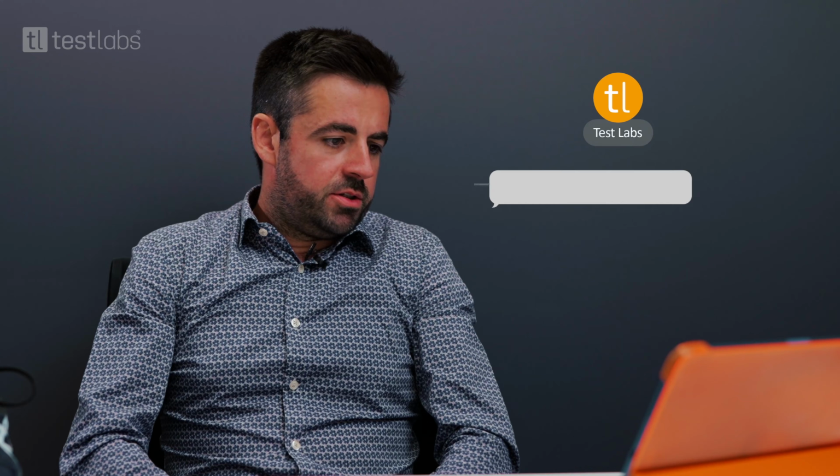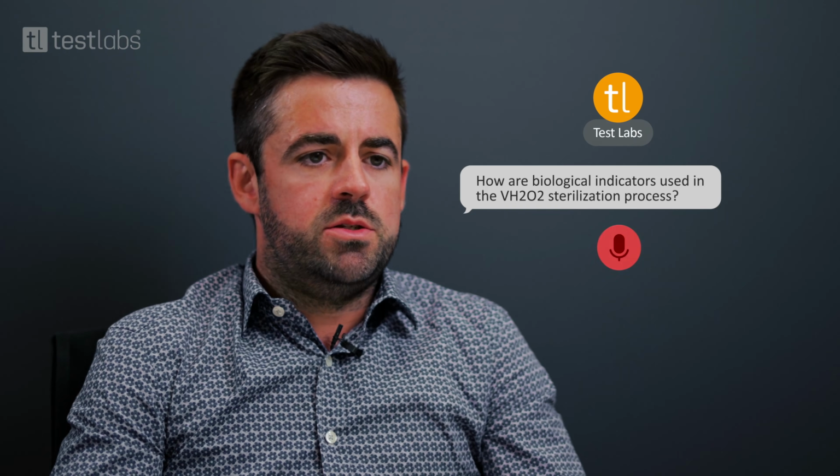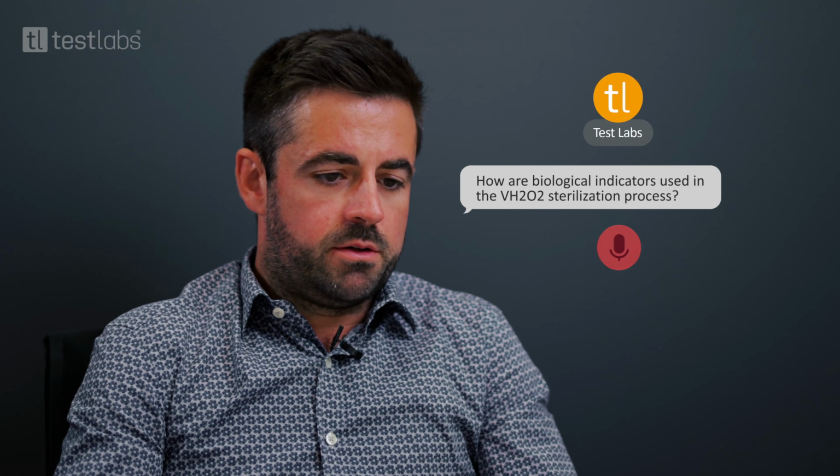How are biological indicators used in the VH2O2 sterilization process? In the VH2O2 sterilization process, you need to use biological indicators for both the process validation, so at the lab or at the beginning of the project, and also for the routine monitoring of every load.